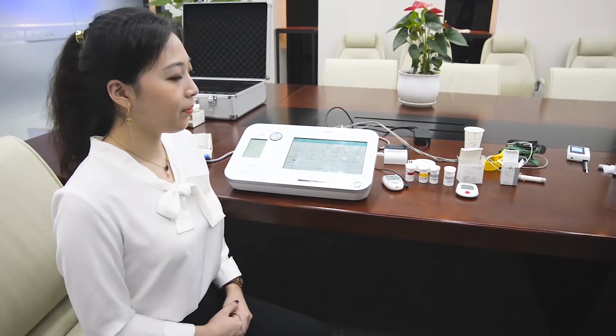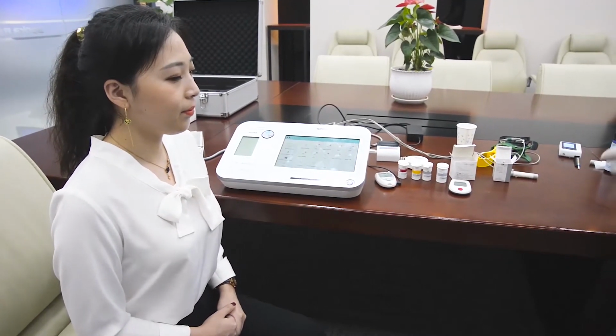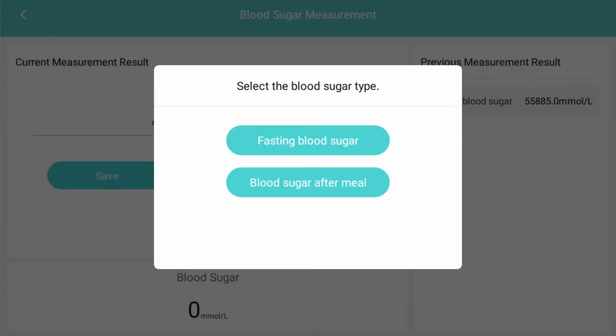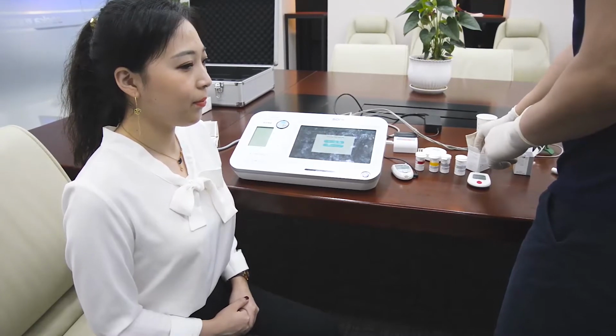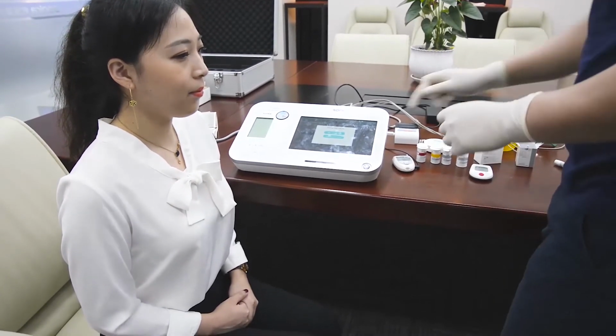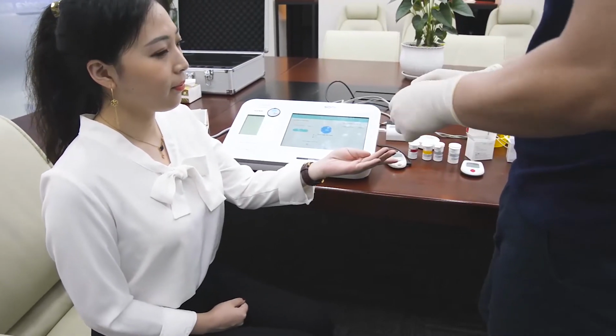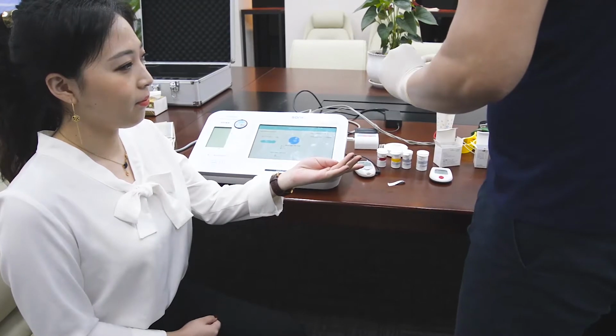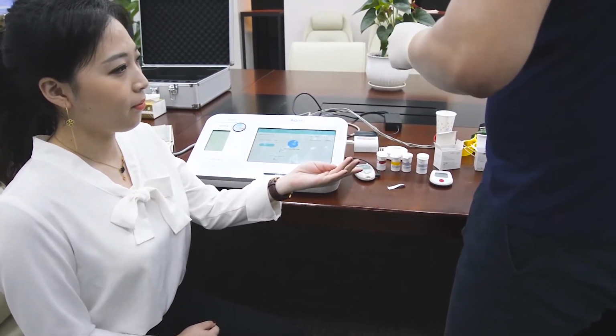Now let's test the blood, please. We have two options. One is fasting blood sugar. The other one is test after meal. You can choose. Now we clean the finger with an alcohol pad. For the doctor, it is better to wear gloves.